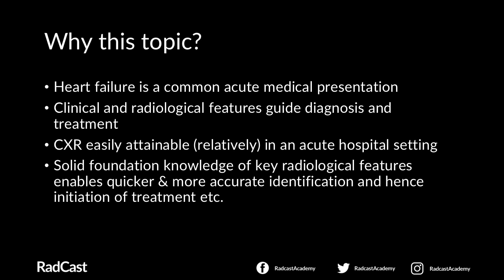So I'm generalising here, but in principle, a chest x-ray should be easily attainable in a hospital setting, with portable x-ray machines that speed up the process greatly. Therefore, a solid foundation knowledge of the key radiological features of the main chest pathologies that can be picked up via a chest x-ray can allow us as clinicians to reach diagnostic conclusions more efficiently and with greater accuracy as well.